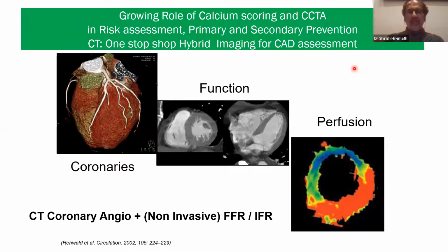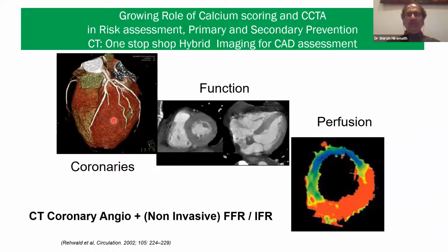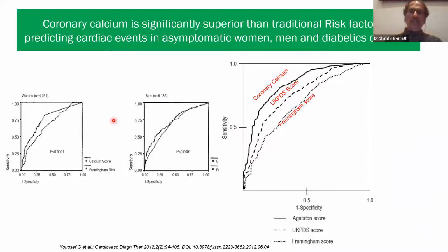The CT coronary angio has advanced, and the ISCHEMIA study, which was presented last year, highlighted a big gain for CT coronary angio. And now we are in a position to add non-invasive FFR. So this is anatomy and this is physiology. And by doing this combination, before you take the patient to the cath lab, you are already mentally ready and the family is also ready that the patient is likely to need all these when we take the patient for angioplasty.